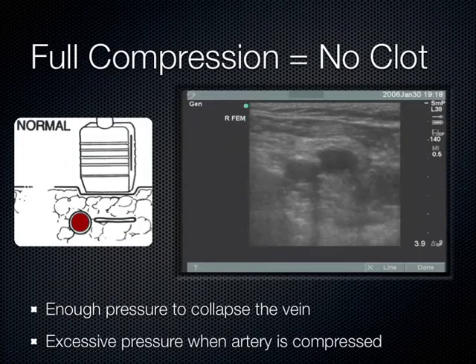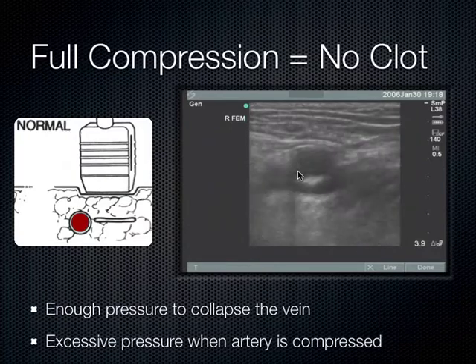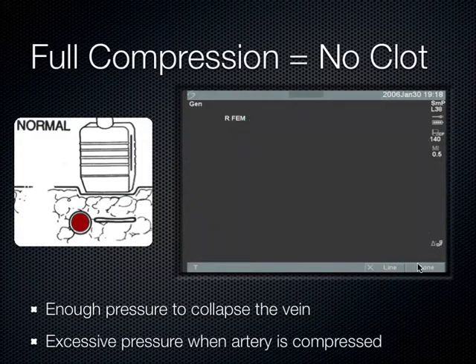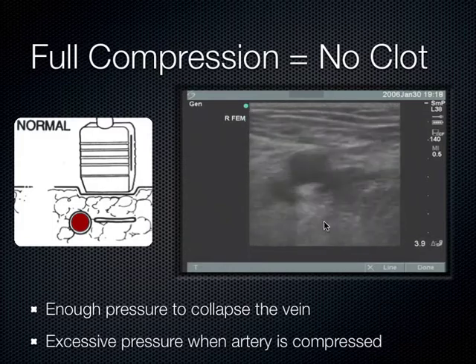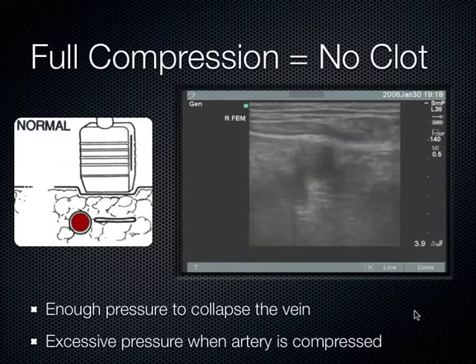On a video, it looks like this. This is also the right leg. Superficial and deep femoral arteries, common femoral vein, we see good compression there. And they're just walking distally as they go. They had to actually increase their depth. And then the video clip starts again. But we see good wall coaptation, meaning that the vein walls come together.